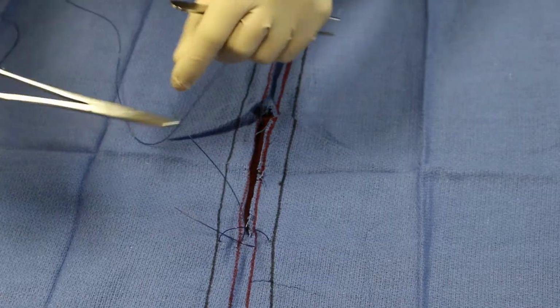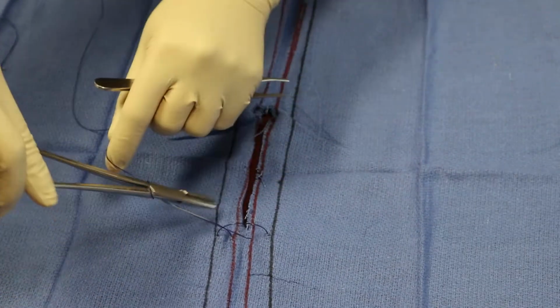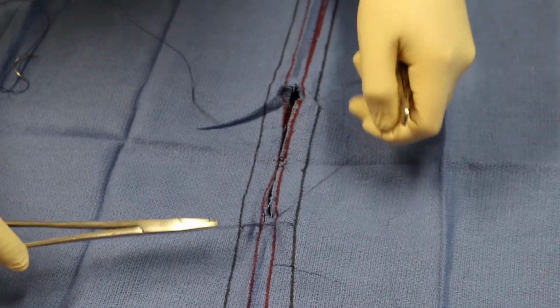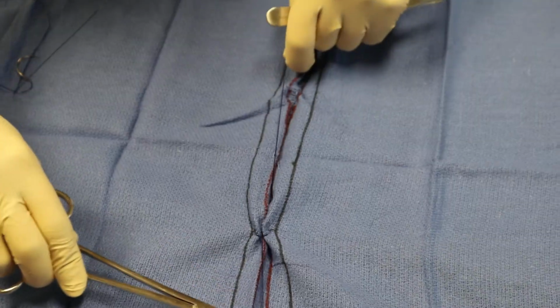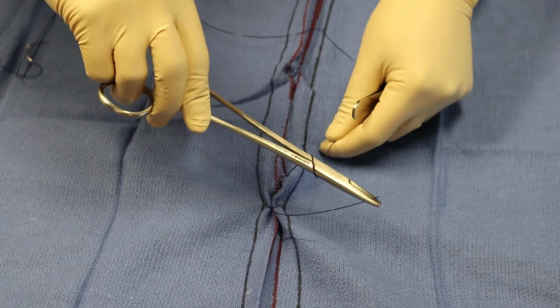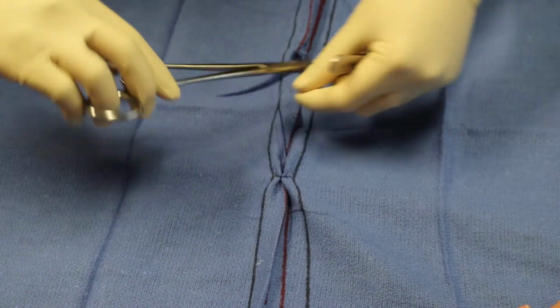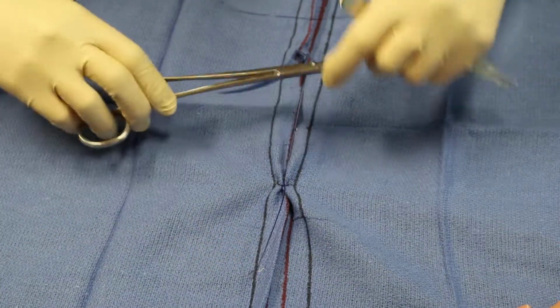So now you're going to do same thing we've been doing. Do 4 throws. And you'll pull parallel with your incision site. Great. Okay. And you see that red line drops down in there, so it becomes deep, and the black one is going to become superficial when you pull. And you see this knot is burying really well because a wide bite was taken.